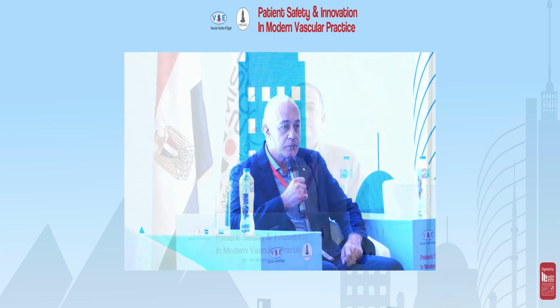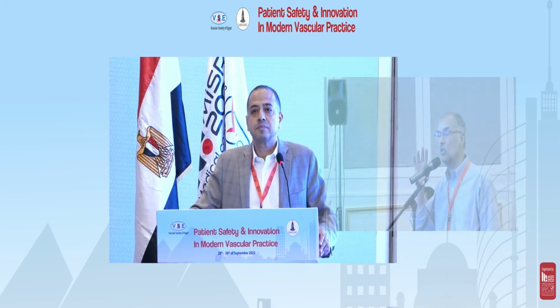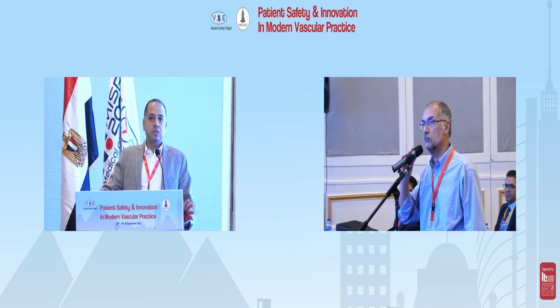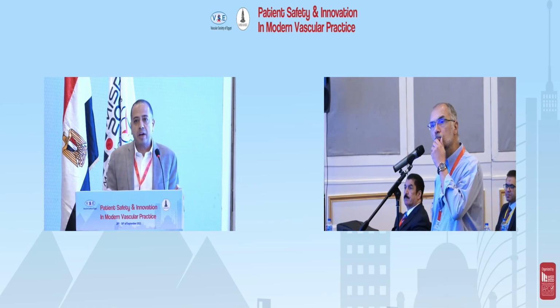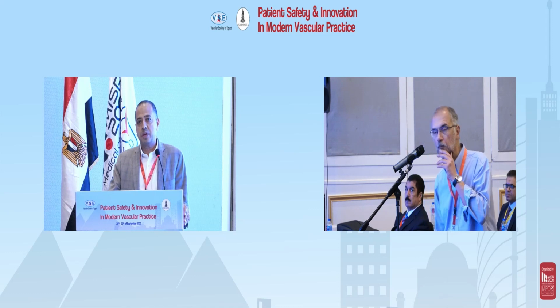Great presentation. Are you aware of anyone who is deploying EVARs totally IVUS dependent? No, I never heard about totally depending on the IVUS. But what I find amazing is the combination of CO2 with IVUS to get rid of contrast. This is a big hit, which I believe is very important.